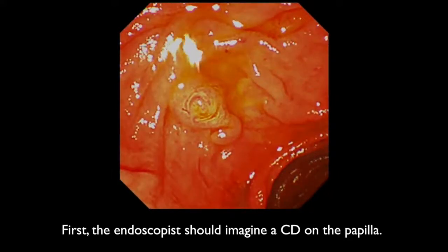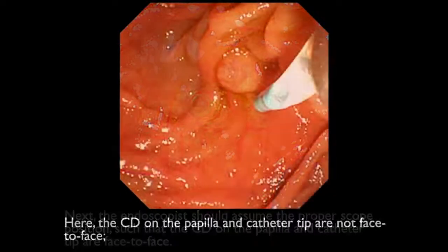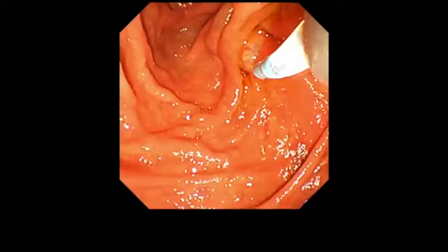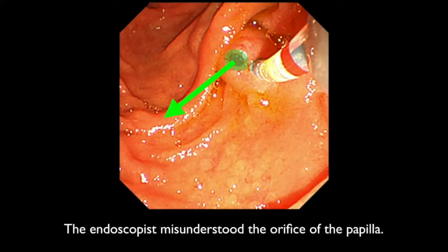First, the endoscopist should imagine a CD on the papilla. Next, the endoscopist should assume the proper scope position such that the CD on the papilla and catheter tip are face to face. Here, the CD on the papilla and catheter tip are not face to face. They are not yet face to face. The endoscopist misunderstood the orifice of the papilla.